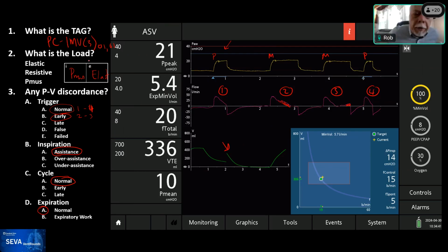I just wanted to point out, this is an obvious difference between IMV type 3 and IMV type 2, like in auto mode. I think the Hamilton ventilators have a thing like IMV type 2. I can't remember what it's called right now, but in IMV type 2, a single spontaneous breath would suppress the mandatory breaths for a period of time.